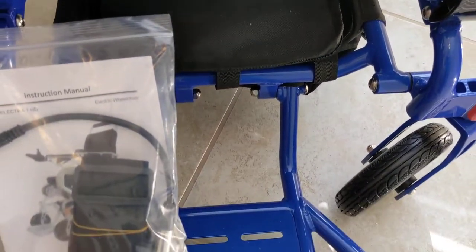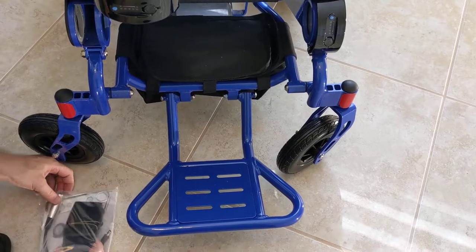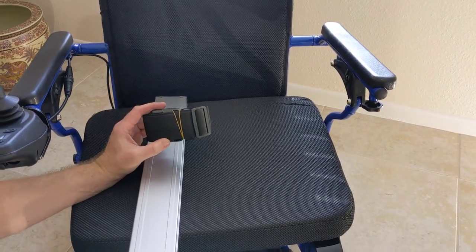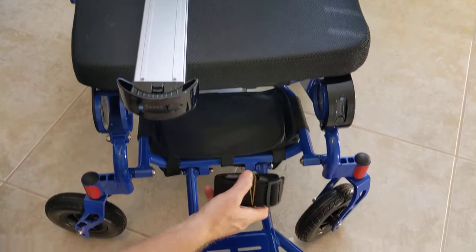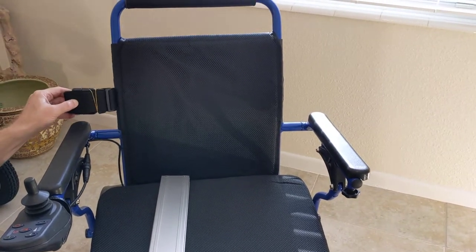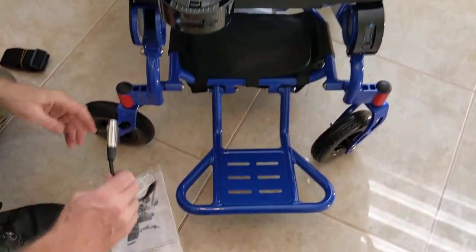Underneath the chair in the weatherproof basket you have the instruction manual, and the chair comes with a seatbelt as well. The seatbelt can be attached anywhere on the chair you'd like. Some people use it around the lower extremities, some around the waist, and some around the chest area — it's flexible and adjustable.